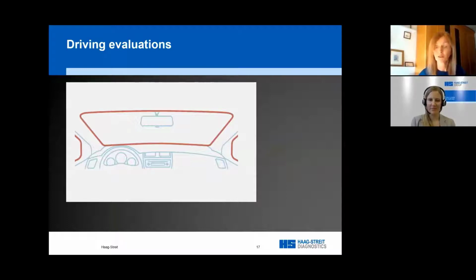In the UK as well, we do have the exceptional cases ruling, where after 1 year of stable visual field loss, people can reapply to regain their license if they have adapted to the field defect. There are certain conditions that they have to meet. So the added kinetic assessment in those situations can be helpful in supporting some, but not all, of those cases.